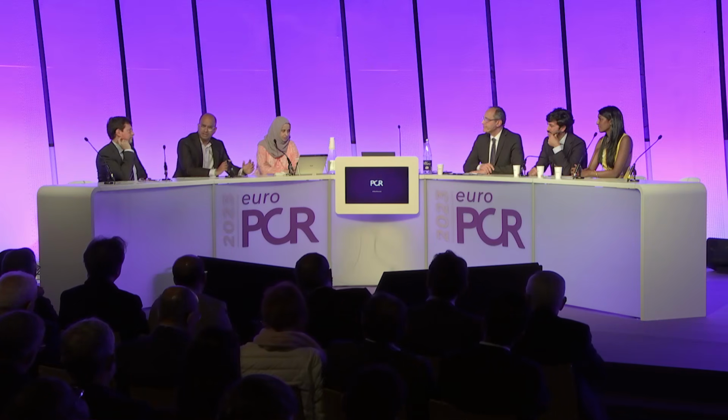I think the key thing for this case is you already know your lesion length. You probably haven't extended it very much. You've achieved your cracking of the calcium. So take NC balloons further at that point. I don't know if you have to go with IVL once you've already used 2 devices, and the NC balloons alone should be sufficient.